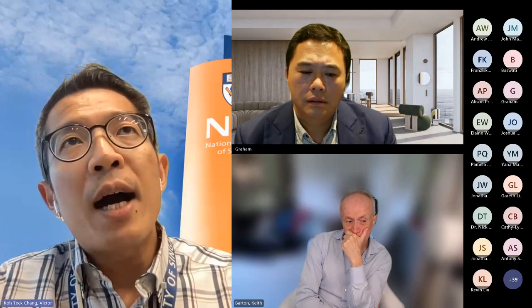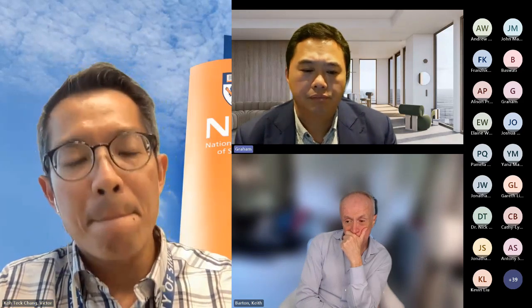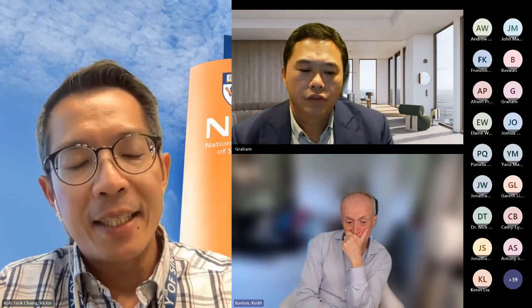That's great, Victor. It's great to see the 3-year outcomes, prolonged beyond that 1-year outcome. Can I just ask you, do you use mitomycin C? In all the eyes in the 3-year outcomes, we did not use mitomycin. Okay, that's interesting. How many do you remove the stent, the ones that you stented, do you think? About 40%. 40%. Okay, that's interesting.